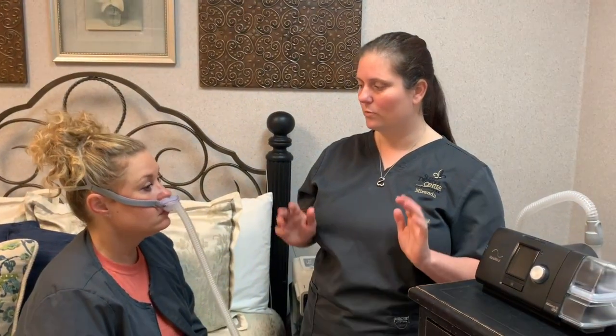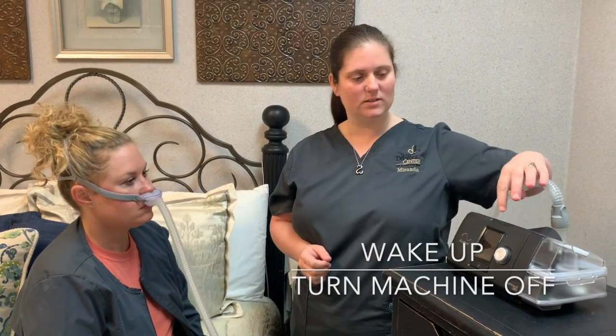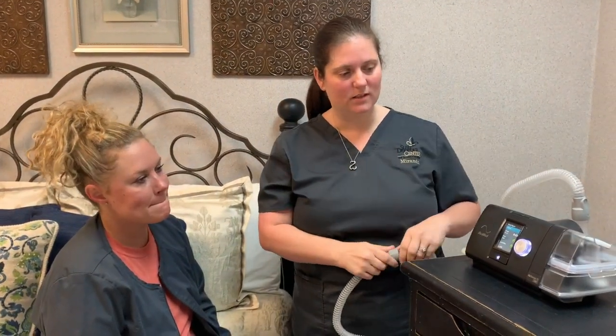Is your inhale and exhale okay? No back pressure when exhaling? Good. When you wake up in the morning, you do have to turn the machine off — it does not auto-off by itself. Just hit the power button and it's off, then remove the mask up and over the head.